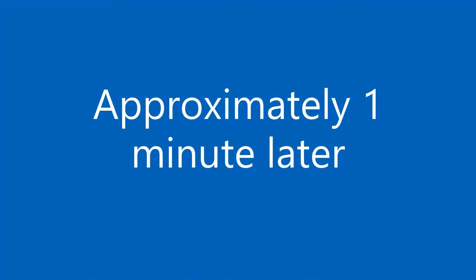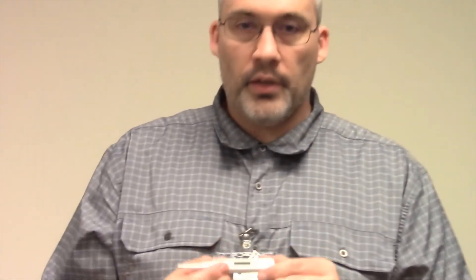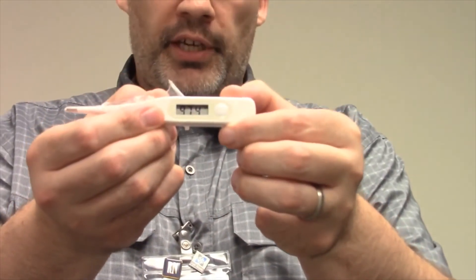This probe cover is just like a little plastic bag that stays over the thermometer. I'm going to turn it on. Once ready, you place it under the tongue until it beeps, and here you'll see my temperature today is 97.4.